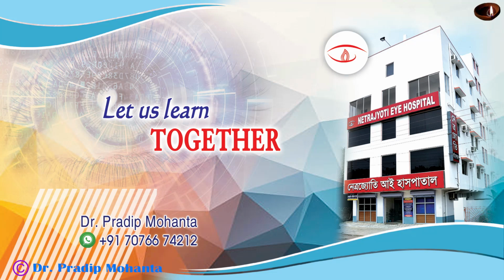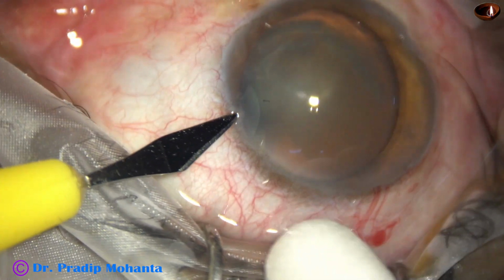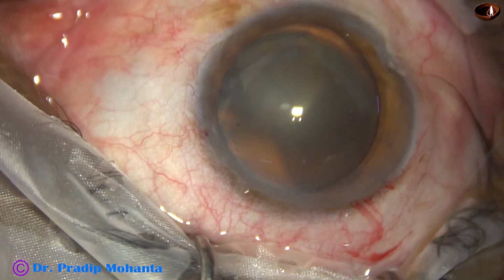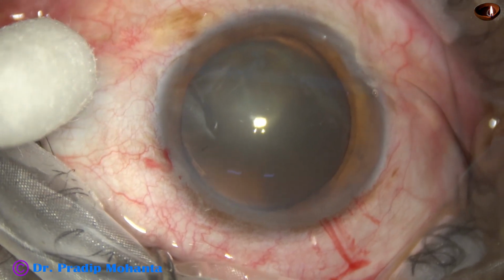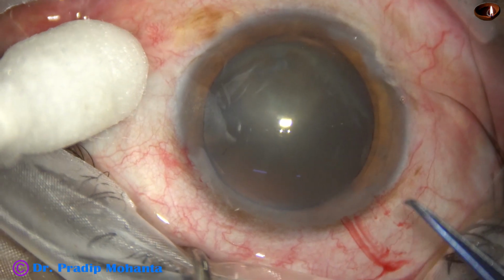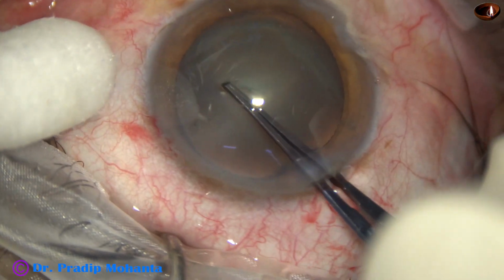In this video, let us observe phacoemulsification of a soft cataract. You can see this is a cataract with grade 2 nuclear sclerosis, and in such cases, it is always easier to manage the nucleus if we pre-chop the nucleus into several pieces.